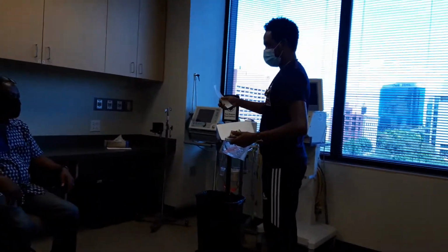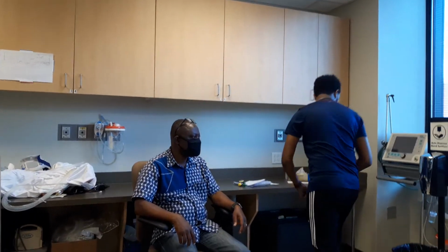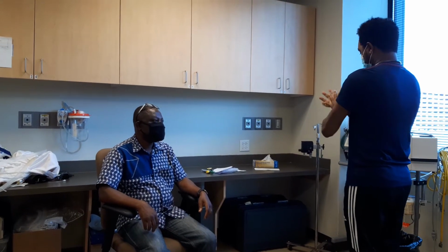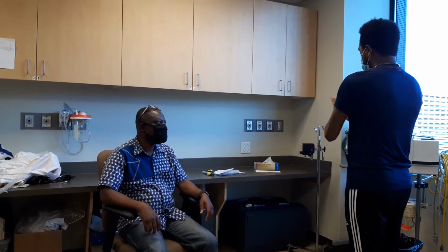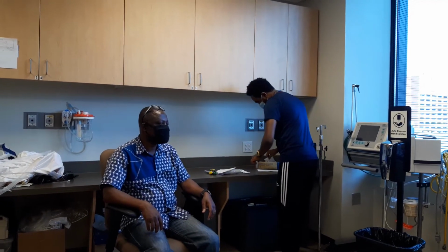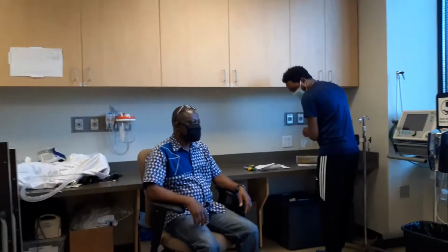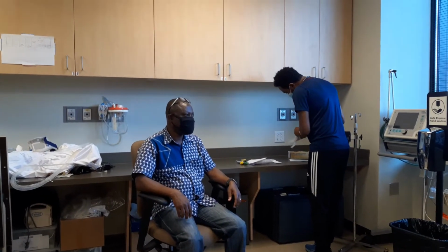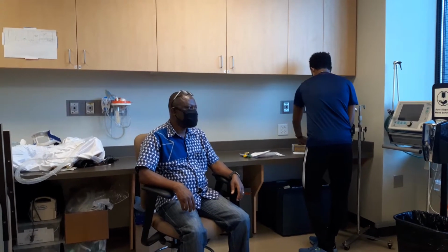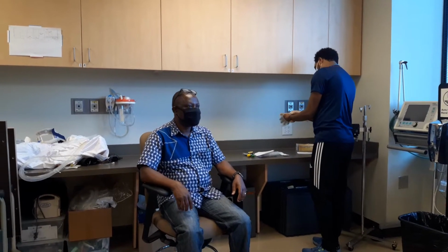Knock. Come on in. Hey, my name is Hagos Med. I'm a student respiratory care tech. The doctor orders you 2.5 milligrams of albuterol and 500 micrograms of Atrovent, the medication via nebulizer every 4 hours. Before I start the procedure, do you have any questions for me?